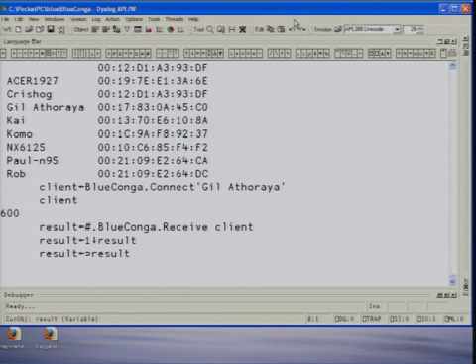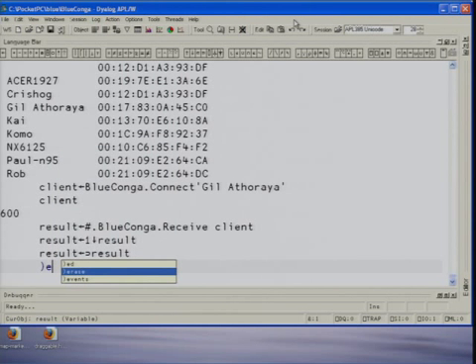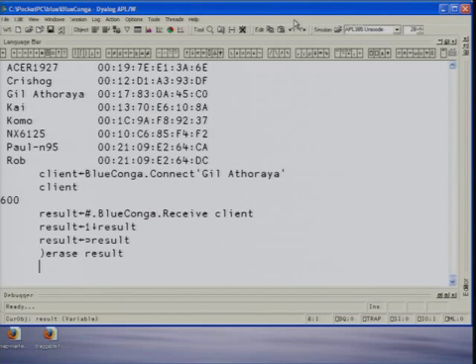The ones that I experimented with had either this serial link layer, or you had a tiny file system on the actual sensor chip, and you just had to read the data from the files. So you can do that as well, and I've written a small derived class to handle the OBEX protocol, so you can query and read files from the file system. I can show you a quick example of that.